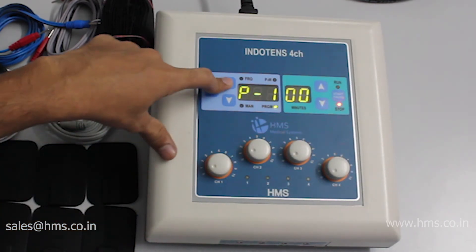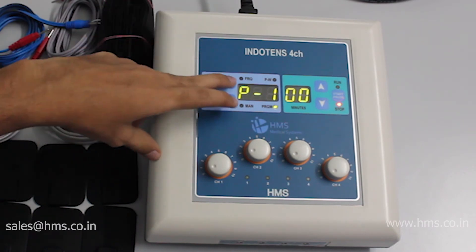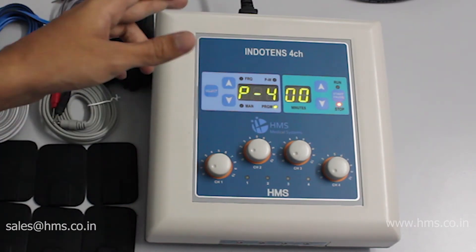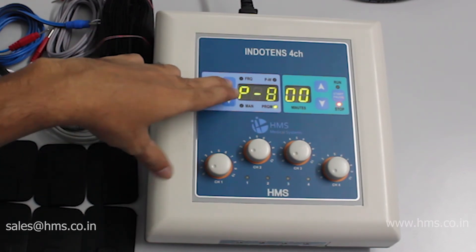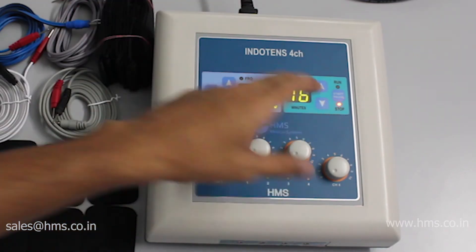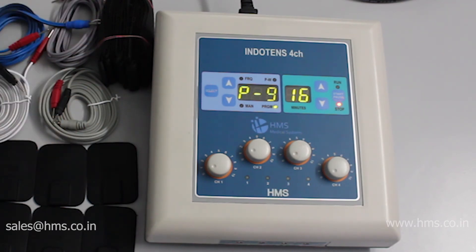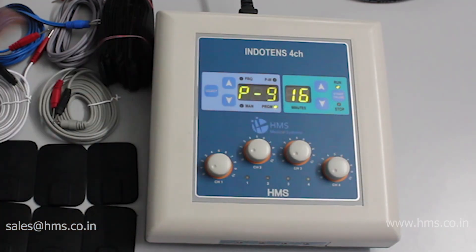As mentioned, there are a total of 10 programs, from P0 to P9. All these programs are described in the manual, which comes along with the equipment. The last program, P9, is a combination of all programs from P1 to P8. Each of those programs runs for two minutes, giving a total of 16 minutes. You get all the functions of programs one to eight in a single pre-programmed sequence.